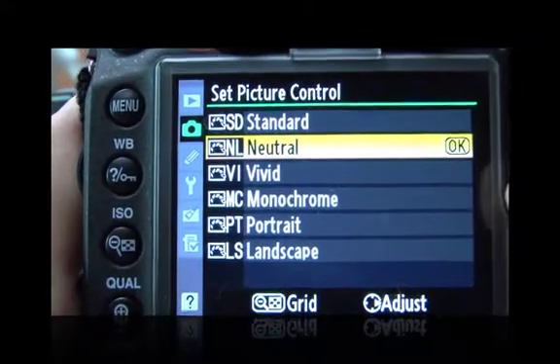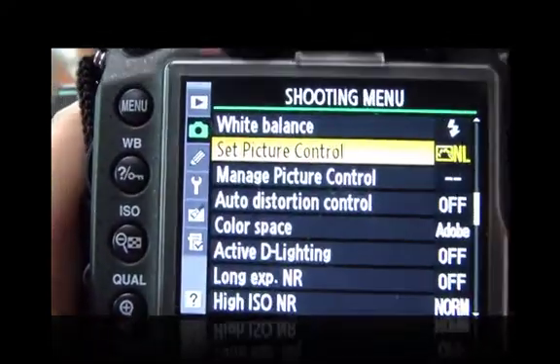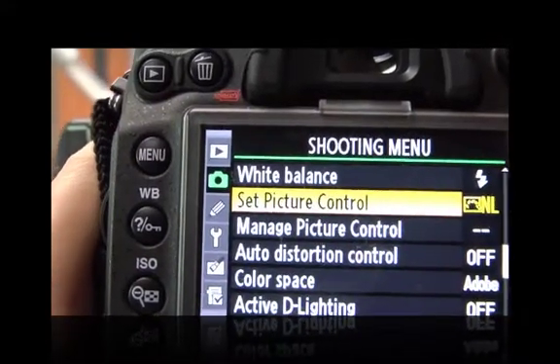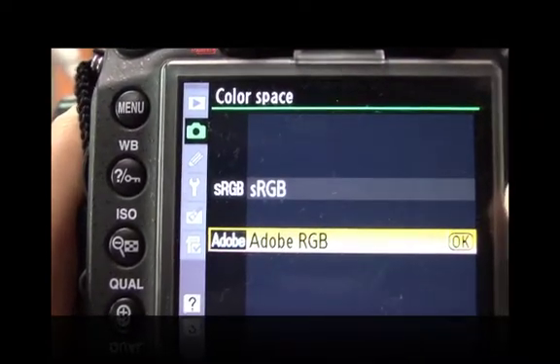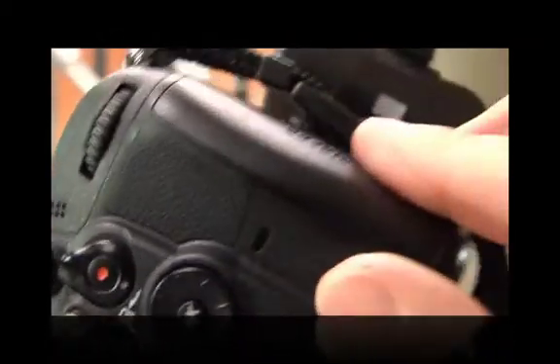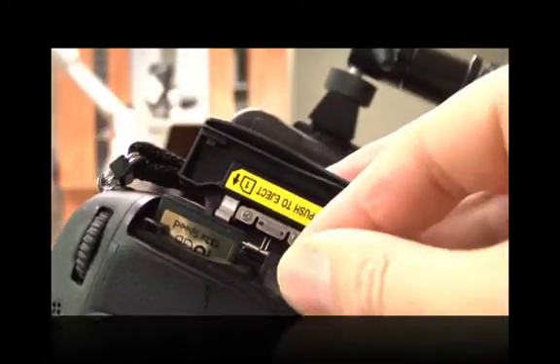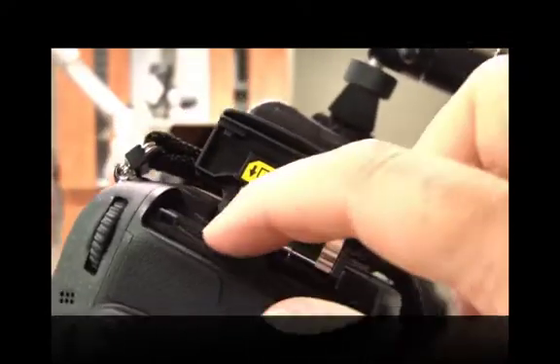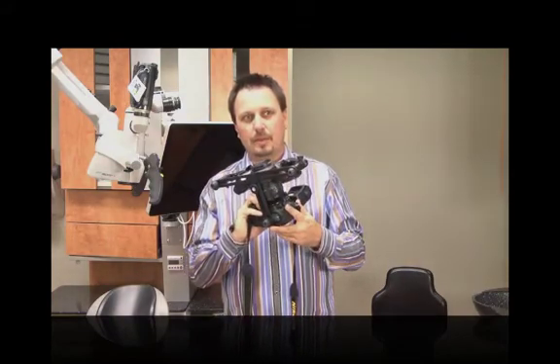The vacation photos I'll show you are set to standard picture control, and if you really want to punch your pictures you can set it to vivid — vivid looks great but not for clinical photography. For color space, I'd set it to Adobe RGB, which gives you a better color space. You can also see the dual SD card slots here, which are much more convenient for importing images.